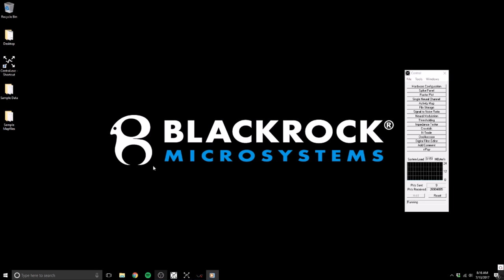Though BlackRock will provide Mapfiles with all electrodes we sell, you may choose to create your own for custom or third-party electrodes that you work with. To get started, let's take a look at how to open a Mapfile so that we can understand the contents.